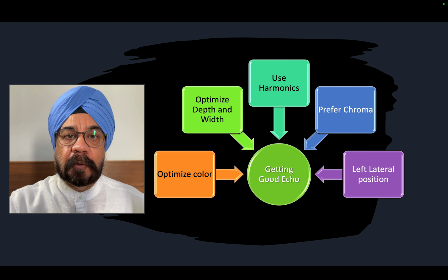You can use the same echocardiogram which you use for an adult, fetal or pediatric echo, but you need to optimize the images. That's very, very important. Coronary arteries are about 3 to 4 millimeters in an adult population, with a flow which is markedly reduced compared with the rest of the LV and RV chambers. The problem is that the coronary arteries are epicardial, on the myocardium, and they move vigorously when the heart contracts or relaxes. In all those situations, it is very difficult for us to assess a coronary artery if you are trying to visualize it.